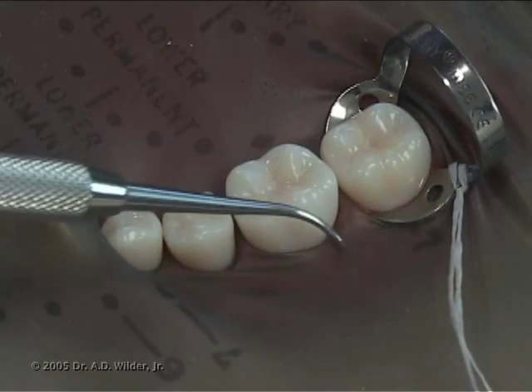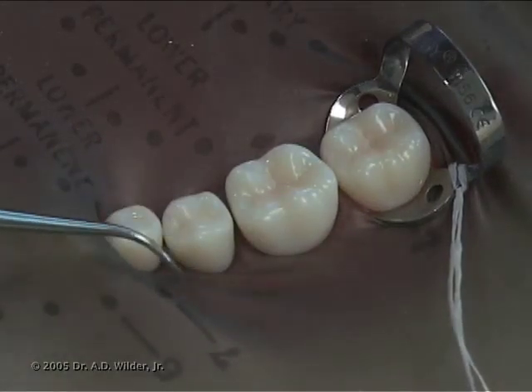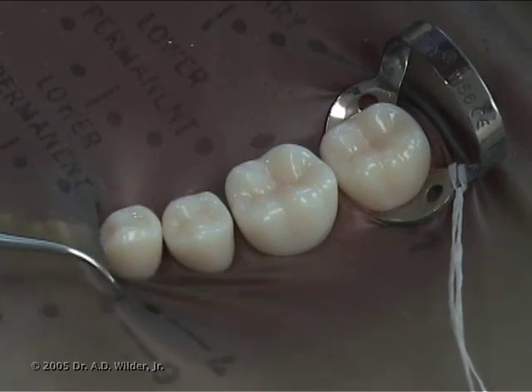You can use an explorer to tuck in or invert the dam around the cemento-enamel junction of each isolated tooth.